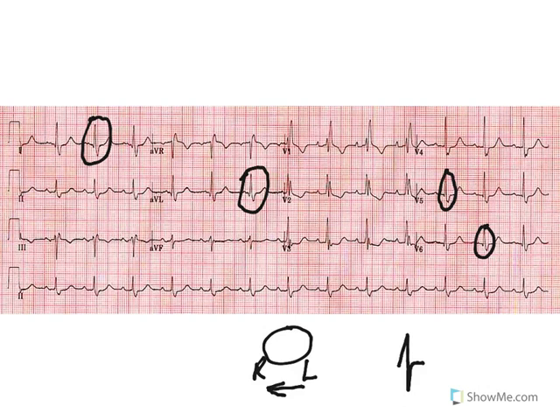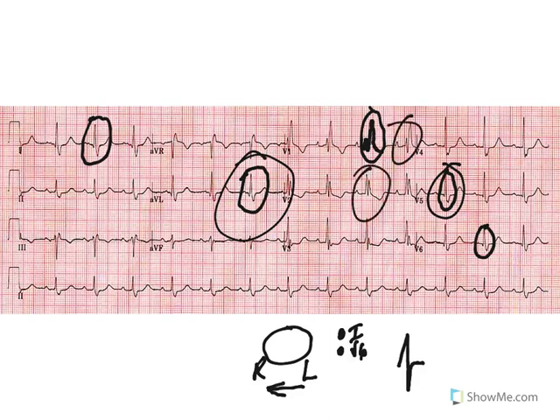And so that's why in my lateral leads, which sit over here, okay, lead 1, V6, and in this one you can look at V5, and in this one you can also look at AVL, that works as well. In those lateral leads, what I'm seeing at the end there is the electrical activity traveling away from me. In V1, at first it travels towards me, then away, then towards me again, and then away again. Same thing, and there you go, there's your RSR prime.